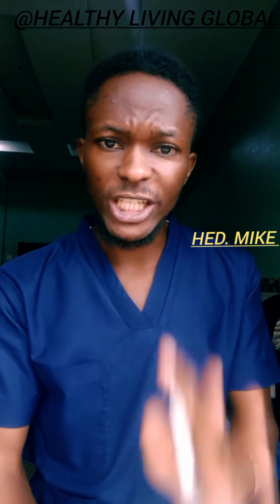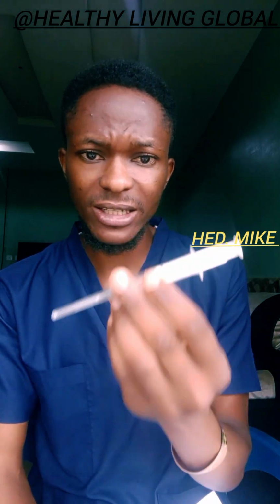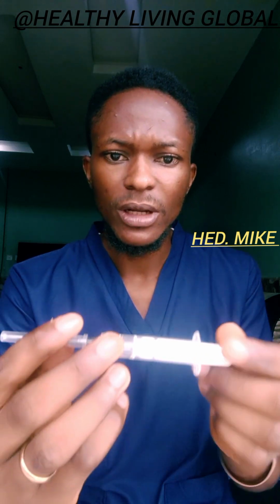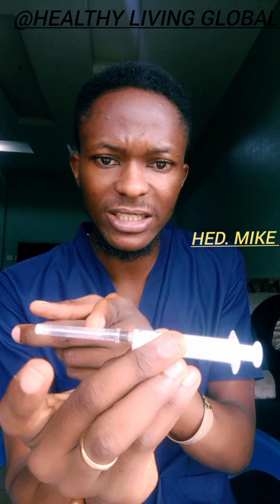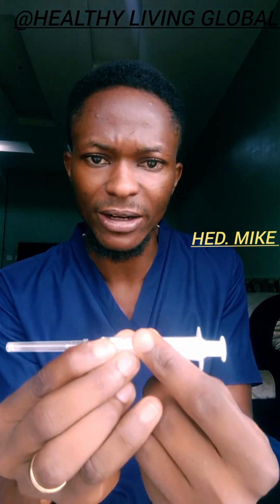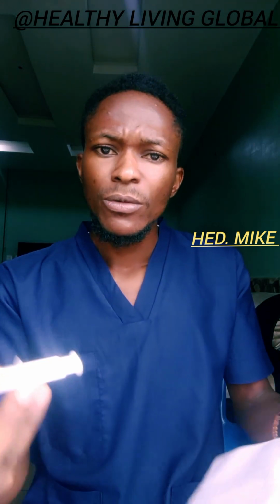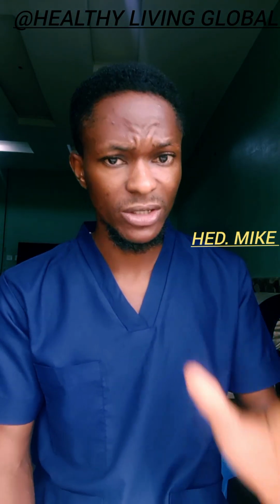Now, prepare your injection as recommended by the manufacturer. Note that a syringe has different parts. This is the needle, this is the needle inside, and this is the cap of the needle. This one holding the medication itself is called the barrel. This is the plunger. Now, if you prepare your injection, you can allow the patient to lie or stand.